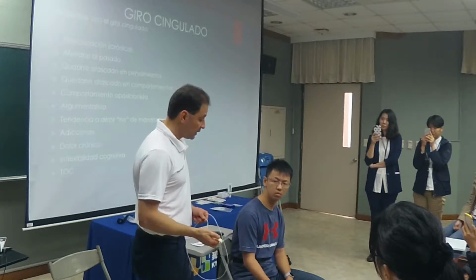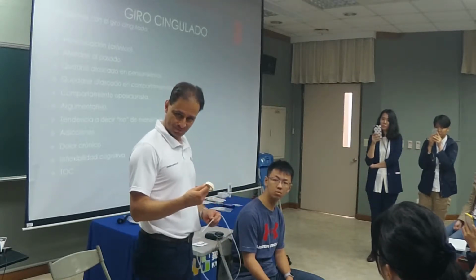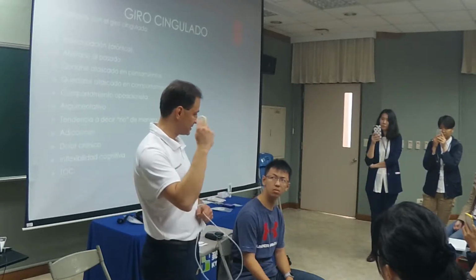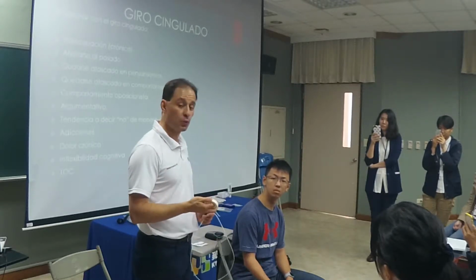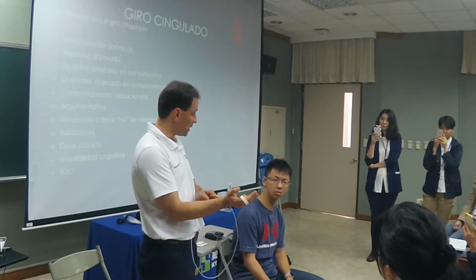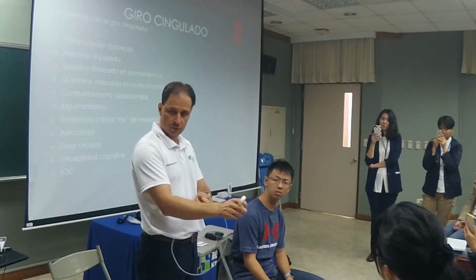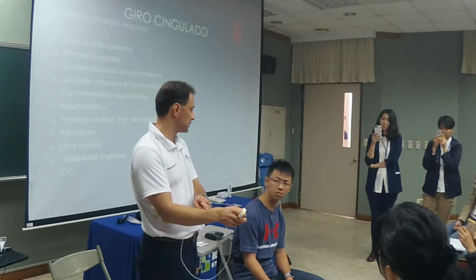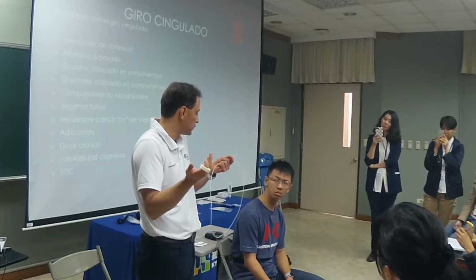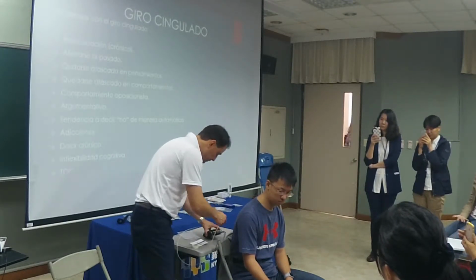Those of you who work in hospitals are going to have amputees, people with no limbs. So where do you place the sensor? You can place it on the amputation site or the other limb. If it's a double amputee, you go with where the amputation is. That's how you do it. Same thing: we're going to place it in the channel.